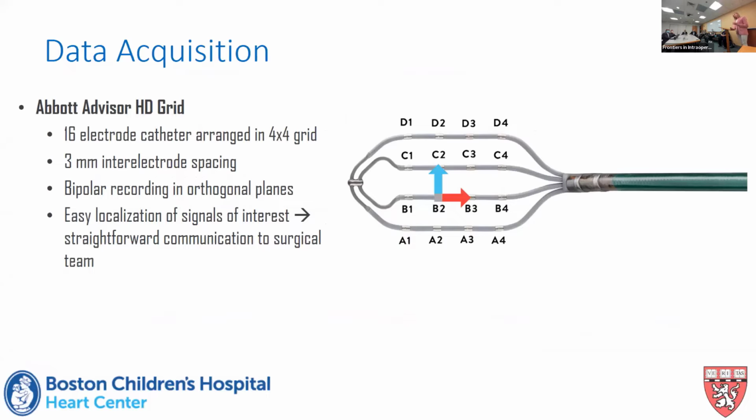The catheter that we're using is a little different than the probe that I showed you before. This is an EP catheter from the EP lab space, so used in a transvenous approach and designed for use in adults. The electrodes are a 4x4 grid. There's no reason that you have to use this particular catheter. We have, and I'll show you, a couple of reasons why this is particularly helpful, I think, and was a critical piece of us developing this technique.